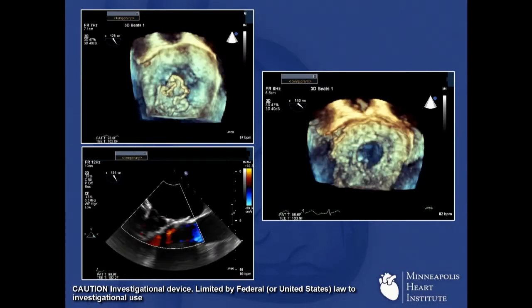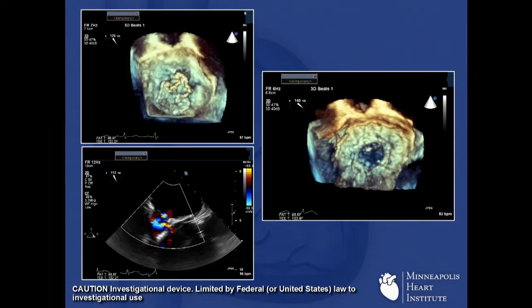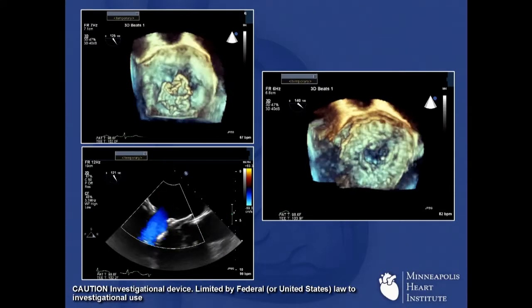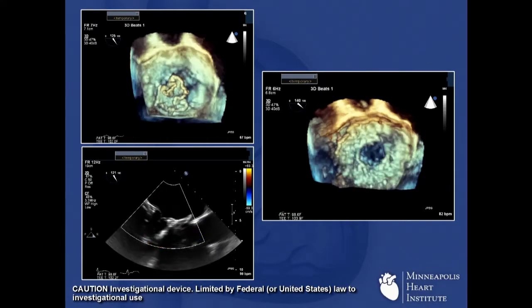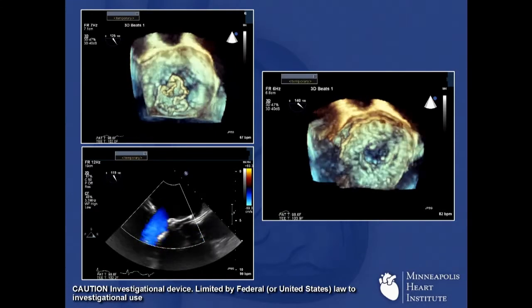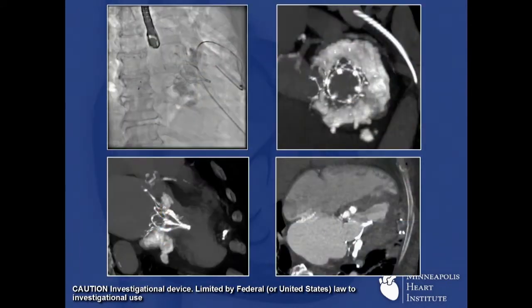You can see in the top left-hand side the valve being extruded, and the final implant is on the right. To our amazement, with this patient with incredible severe MAC, there's not a pixel of MR. It's really just an incredible result — like the valve was made to fit in this annulus. If you look at how it sits in there with the MAC, it was a beautiful fit.